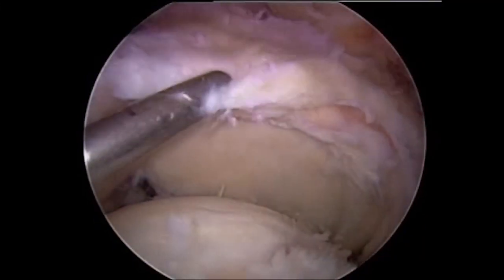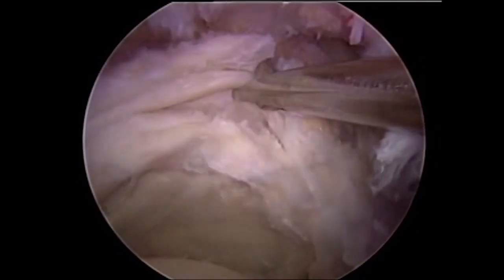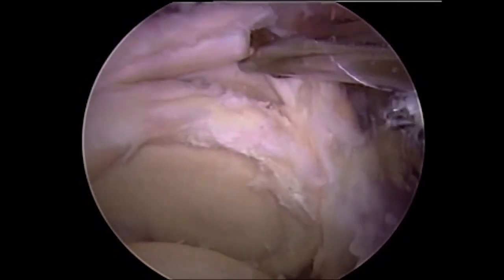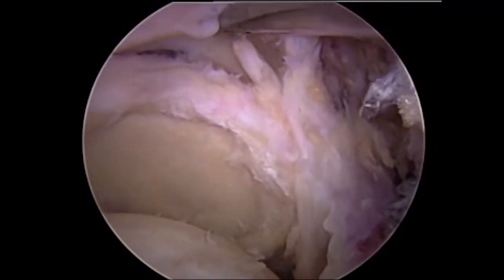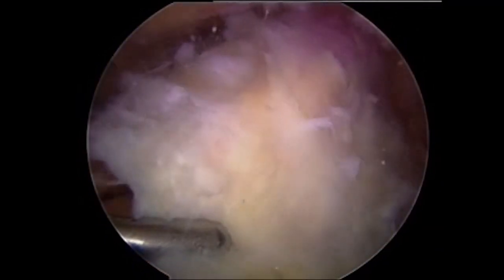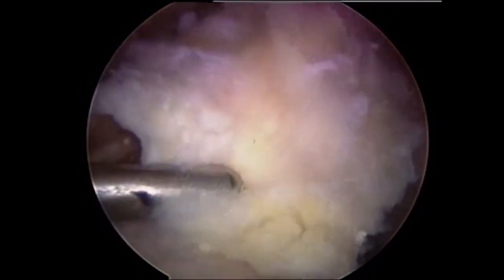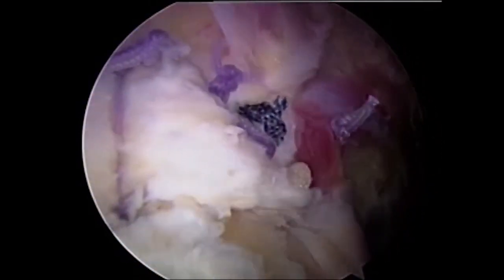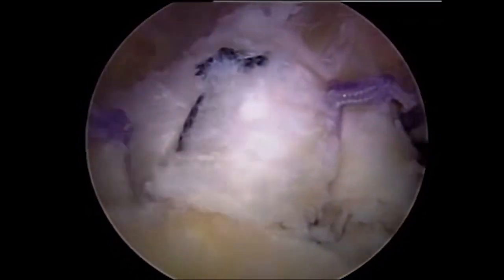In this third example, left shoulder beach chair position, we can see again a very retracted tear, and in this particular example, a posterior interval slide is carried out. This posterior interval slide is continued all the way to the scapular spine, and after that posterior interval slide is completed, note that we can lateralize this rotator cuff tear that seemed unrepairable back to essentially the most lateral aspect of the anatomic footprint and achieve a complete repair.